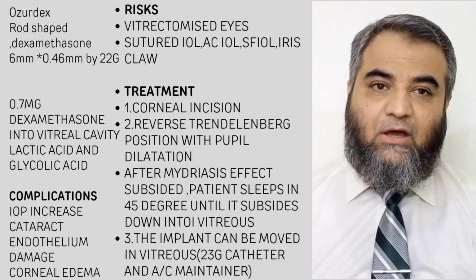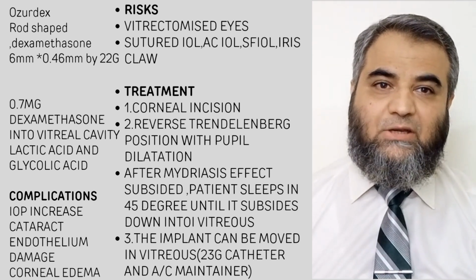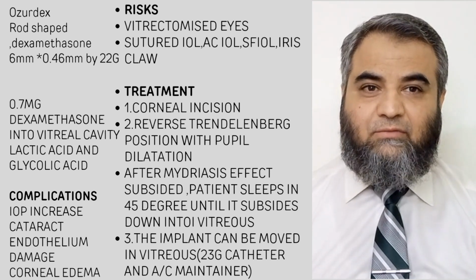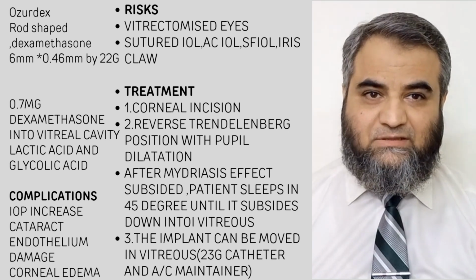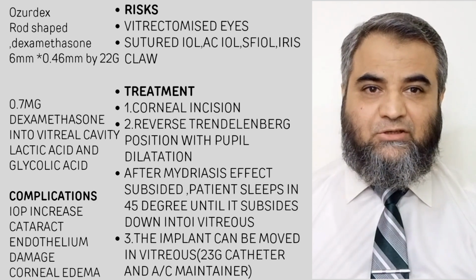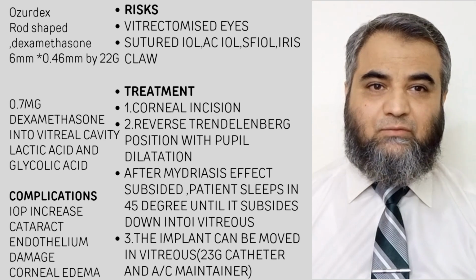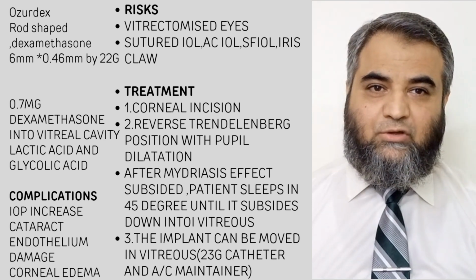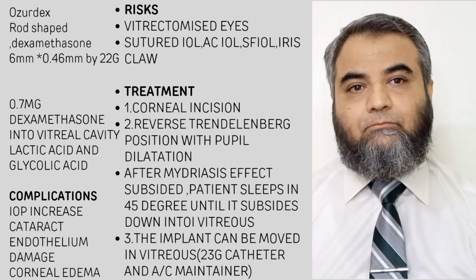This is one way. The other way, if it has to be removed from the anterior chamber, is to use viscoelastics. Otherwise, if we keep using fluids, it will keep on moving and it is difficult. Viscoelastics can be helpful to stabilize and maintain the anterior chamber and push it out gradually with the paracentesis. Whenever you try to hold it, it will start breaking into pieces. So gradually it should be taken out from that position with the port.